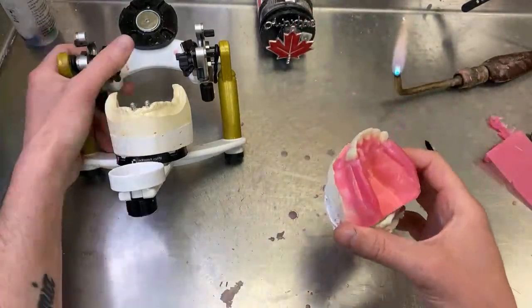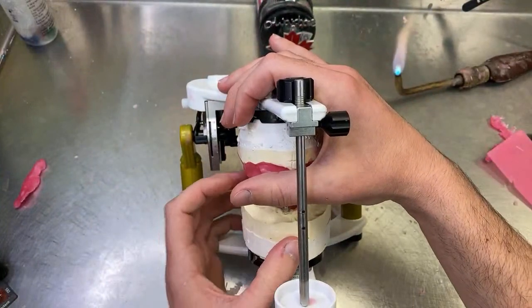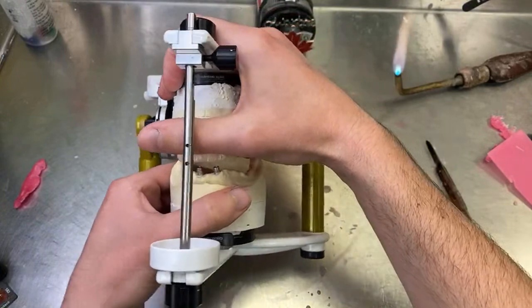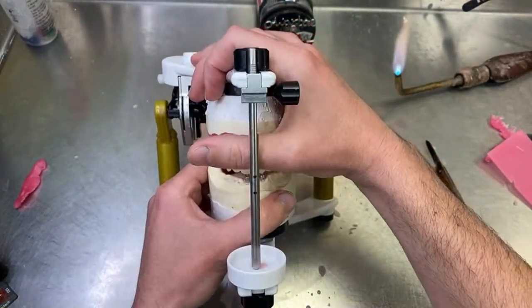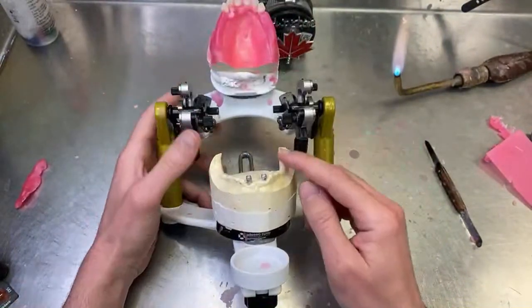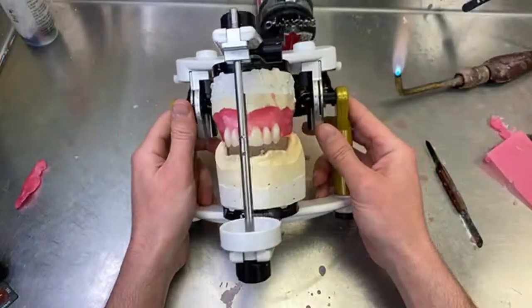Okay, so six anteriors done right here. You can see that they're leveled. And what I'm looking at here, I don't know if you can see with my fingers in the way, is how straight they are compared to the retromolar pads here. Because I know where the plane of occlusion is going to be.